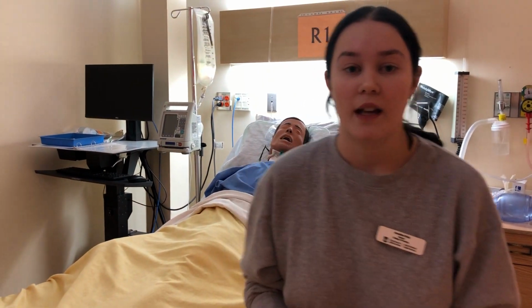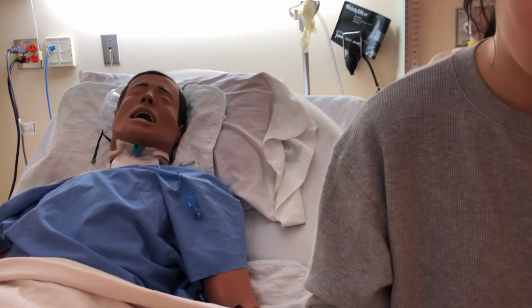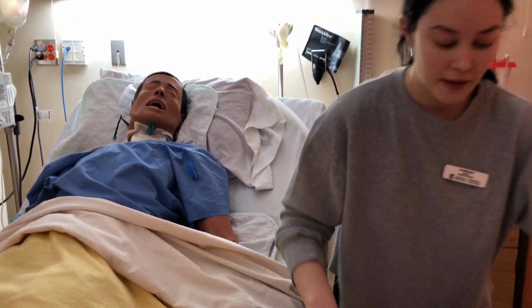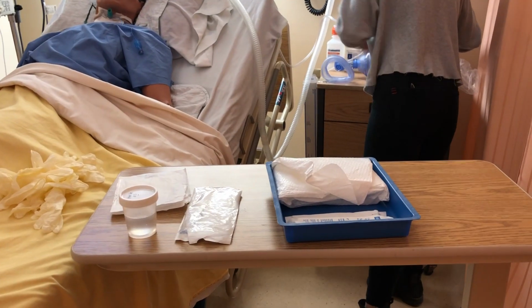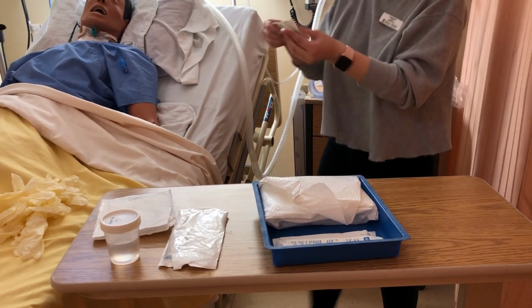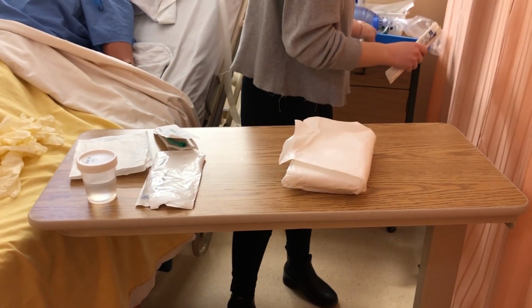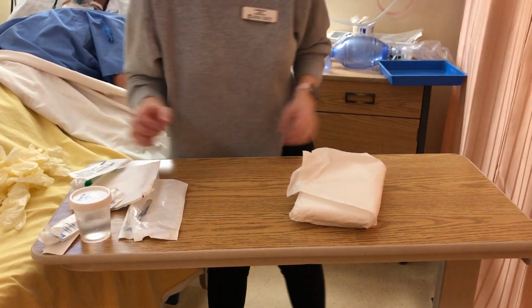Now I'm going to demonstrate how to do the dressing change and the inner cannula change. My patient has their oxygen monitor on, and they're still at 98%. So they're doing good. I'm just going to set up my tray, and also get the size 7 inner cannula for when I change it.